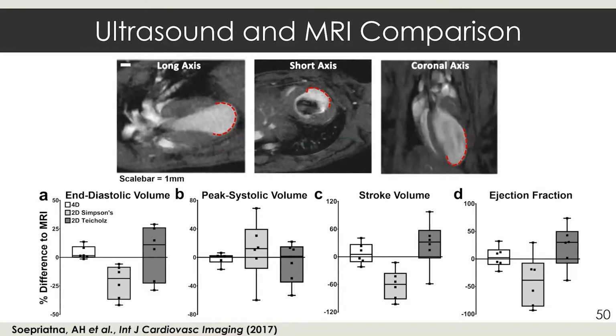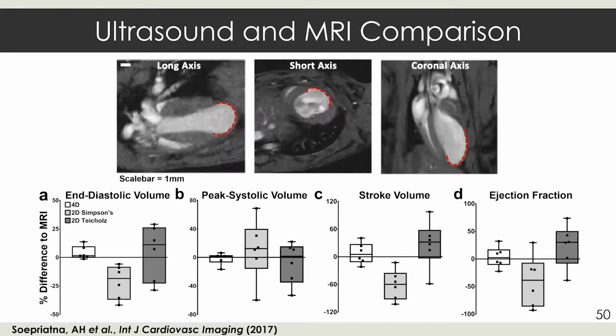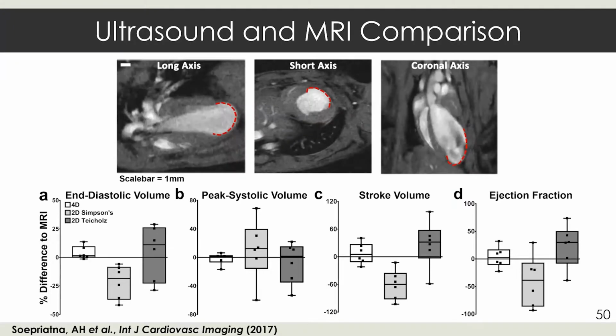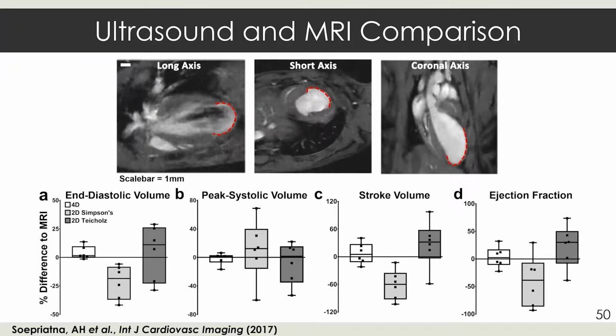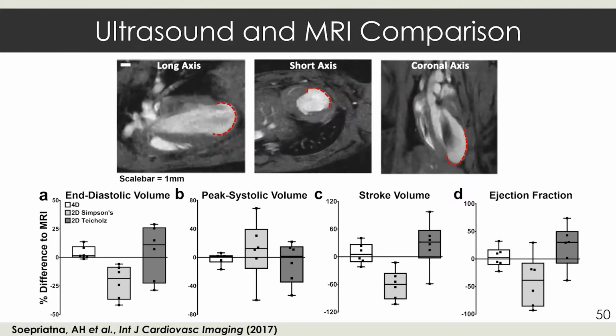And yeah, I think as the technology advances, especially with the 2D arrays, we're going to be getting to the point where it's not just focused on aortic valve and mitral leaflet dynamics, but ventricular contraction with these volumetric assessments. But I think the first generation is likely going to be acquiring multiple volumes through different cardiac windows in clinical and large animal studies, and then collecting and merging those 4D data together, similar to what we're doing slice by slice with the small animal approach, to get clinical data that is similar to what we see here with the mouse.